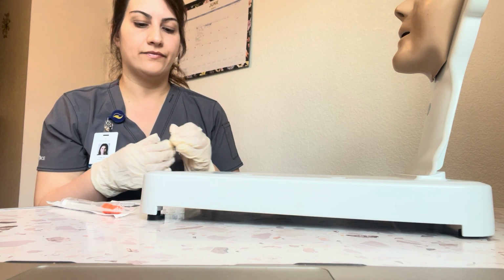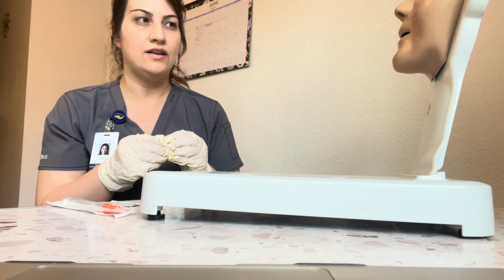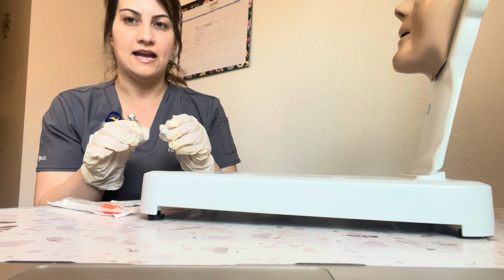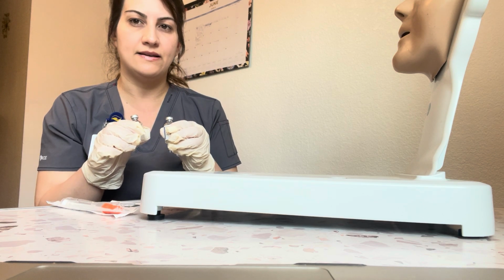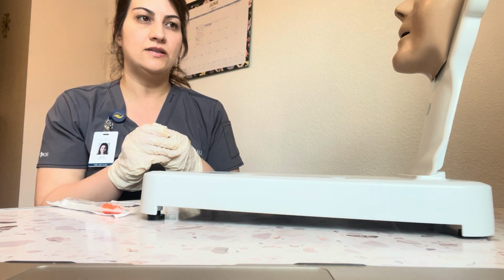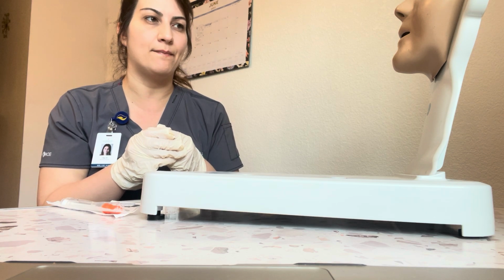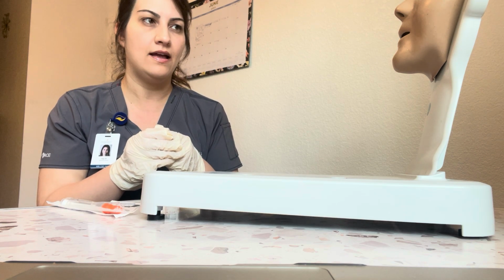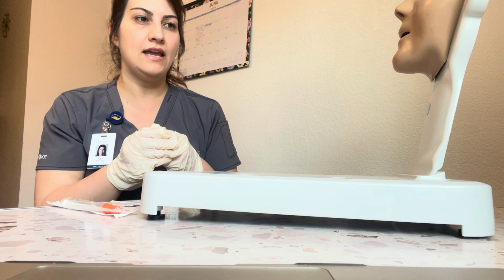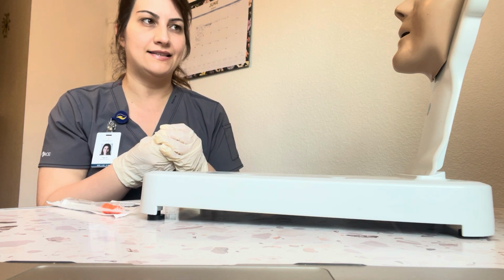Next, do you have any questions for me? No questions? Okay, third time verifying against MR. All right, so I just want to let you know that upon injection, you might feel a little bit of stinging and burning. That is normal. And then I'm going to get started.